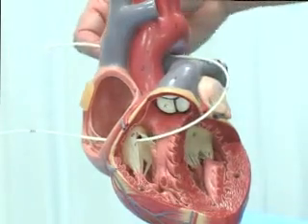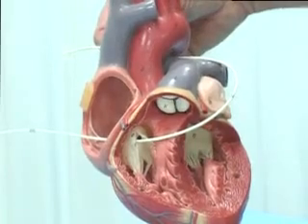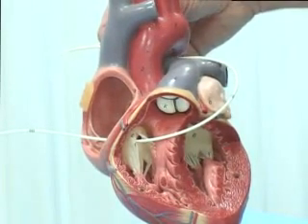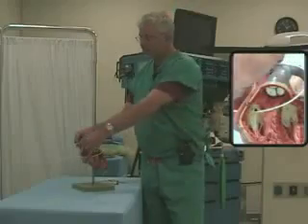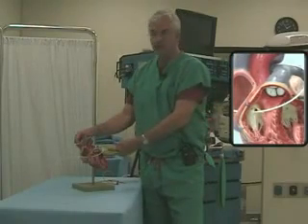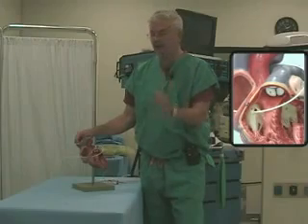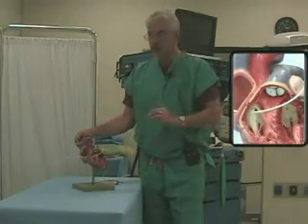As you continue to float the catheter out, you'll eventually get a wedge — that's when you've occluded the pulmonary vessel you're in, which is why it's called pulmonary artery occlusion pressure. That gives you a damped, indirect measure of what's going on in the left atrium. It's not a direct measure by any stretch — it is damped and indirect — but that's what the wedge is all about.